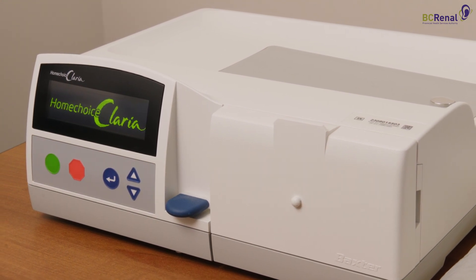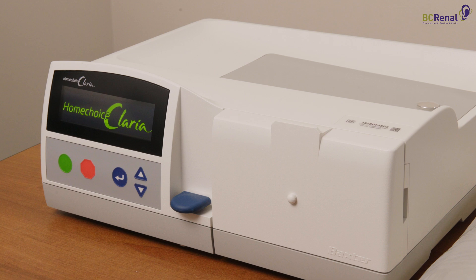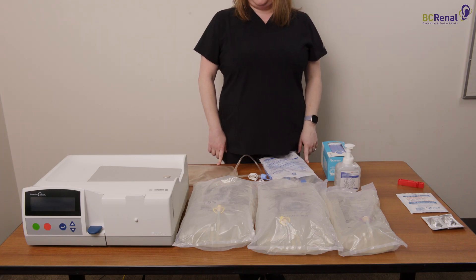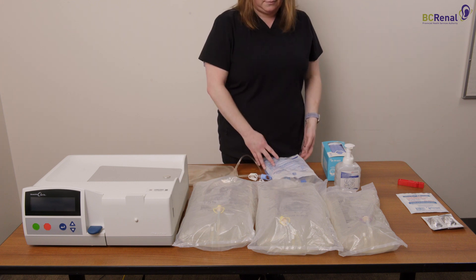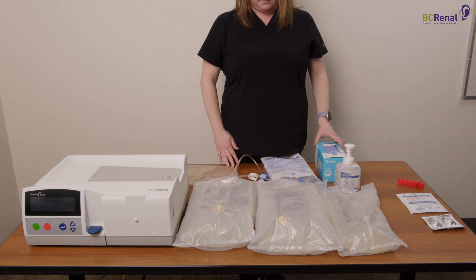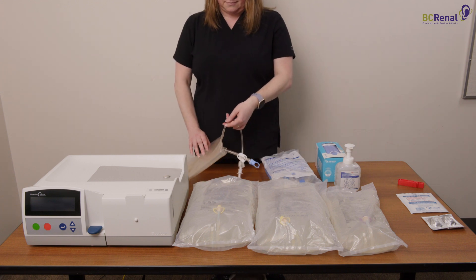The Claria Cycler can be set up anytime during the day so that it's ready to use whenever you want to start therapy. To begin setting up the Cycler, you will need to gather all of your supplies. You will need the correct solutions, a cassette, hand gel, and a face mask. You may also need one to two drain extension lines, a patient line extension, or a drain bag if you are using one.